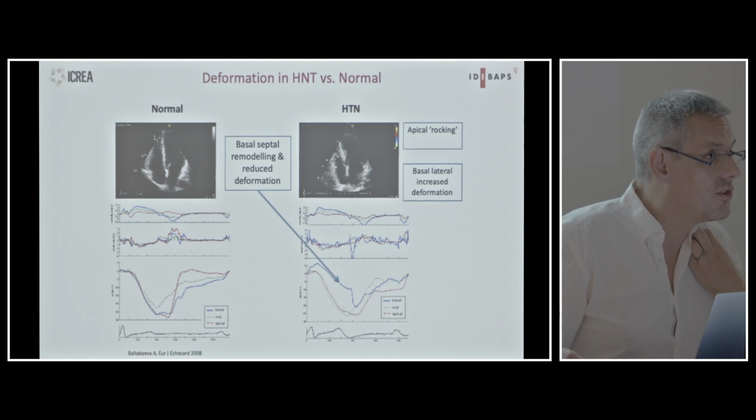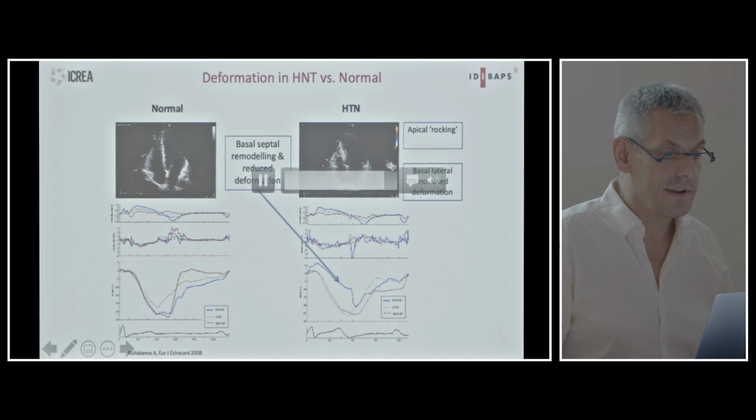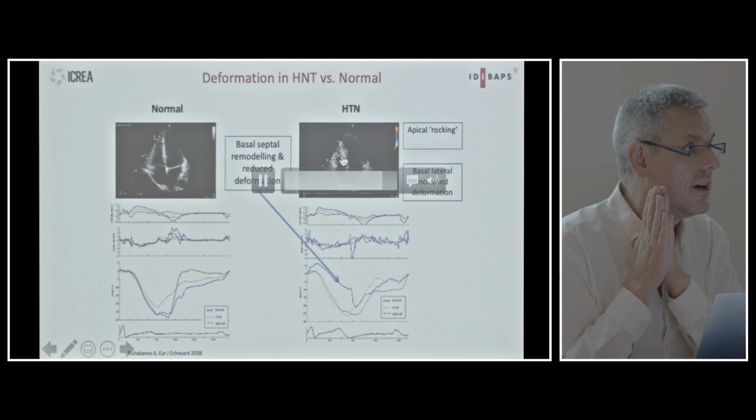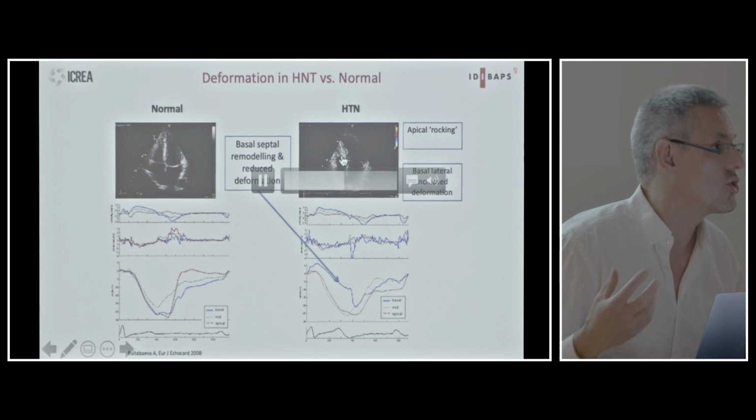And that's also where I don't like the guidelines, because some people have been saying that for the analysis of the strain, you need to not include the septal bulge. Sorry, it's tissue, it's important, you should include it.